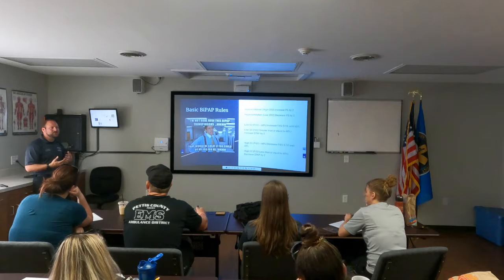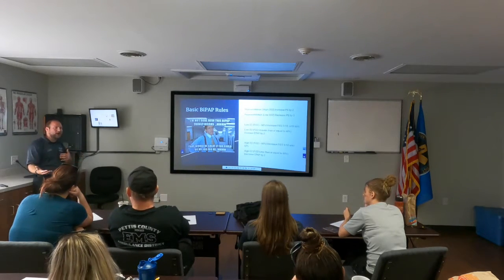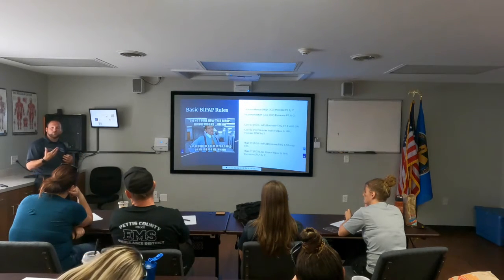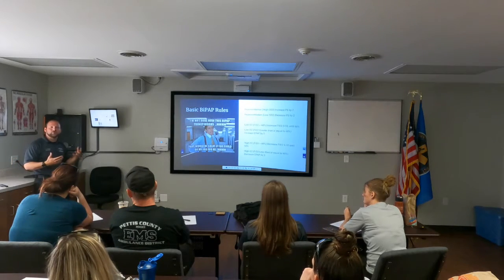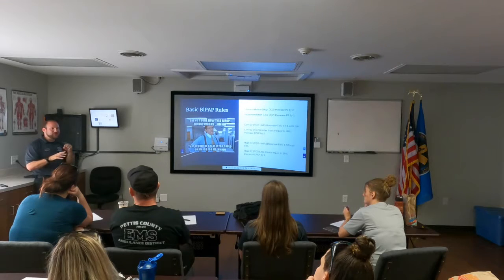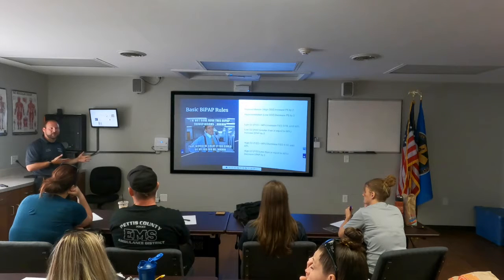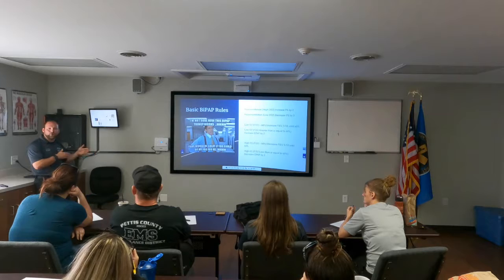There are some things you can do for the individual that has really high variations between their IPAP and EPAP, like a really bad COPDer who, let's say we pick them up at Bothwell and their initial settings are like 20/12. That's pretty high inspiratory pressure, and as soon as you take them off of that and put them on ours, all that support they've had is going to be lost. You may have to start in CPAP mode and work your way up to a better IPAP.